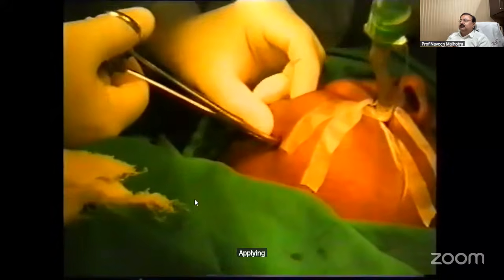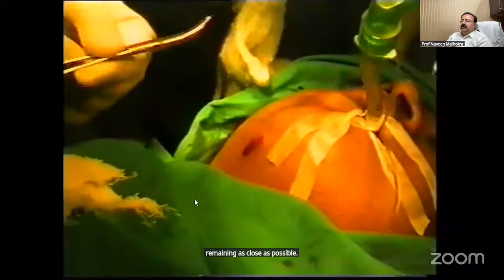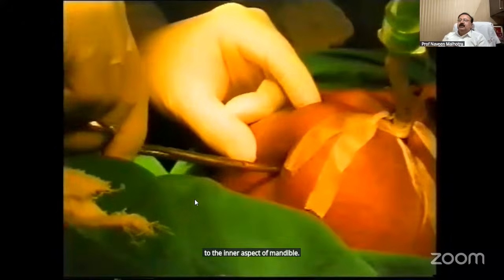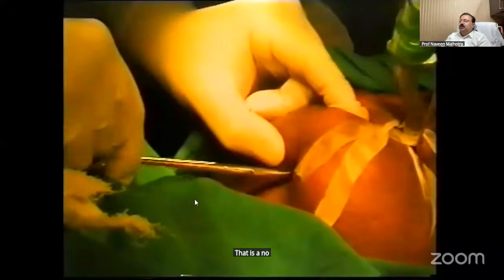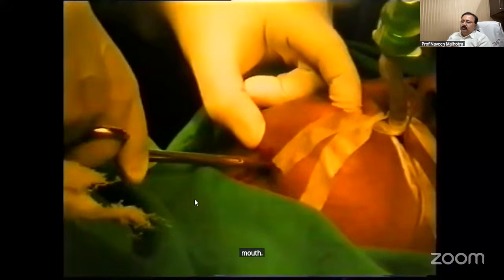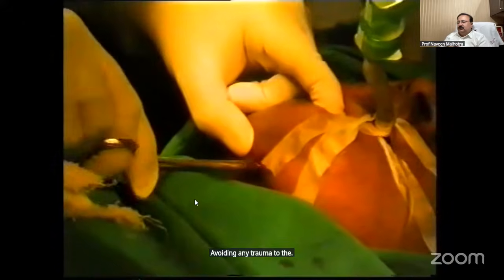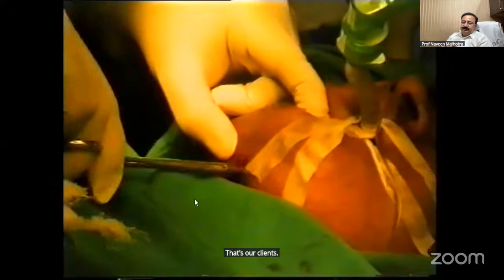curved artery forceps, applying counter pressure through your other finger, remaining as close as possible to the inner aspect of the mandible, that is a no man's land, and open into the mouth and the floor of mouth under vision, avoiding any trauma to the ducts or glands.